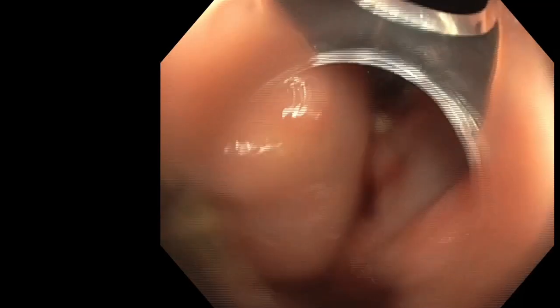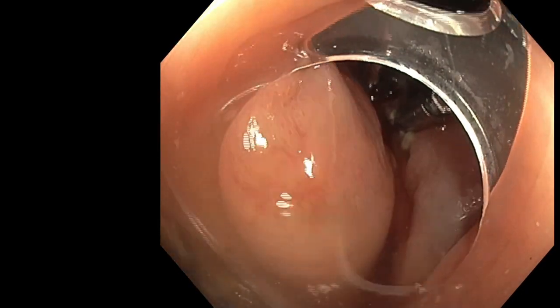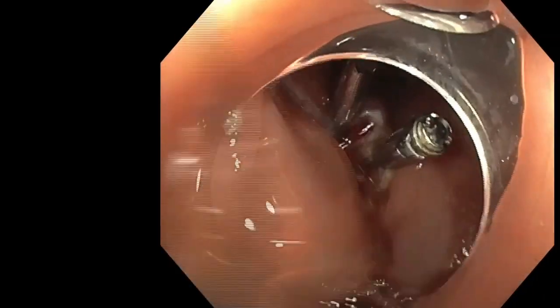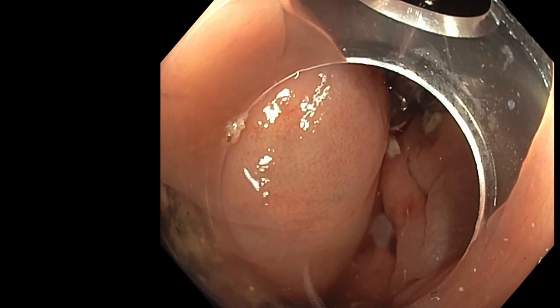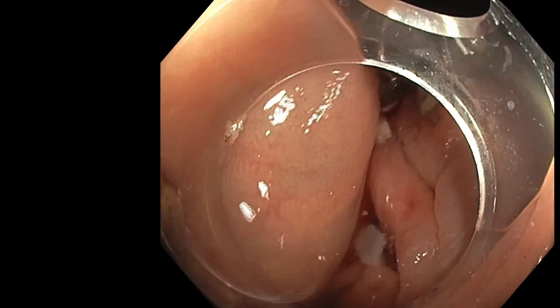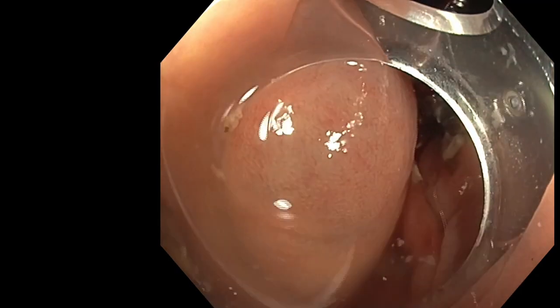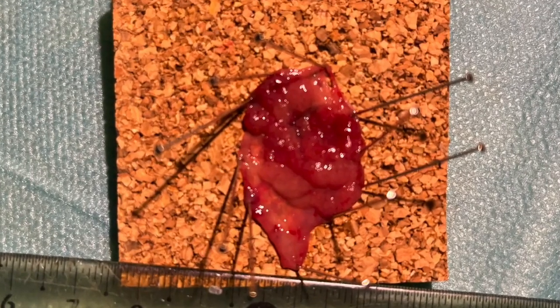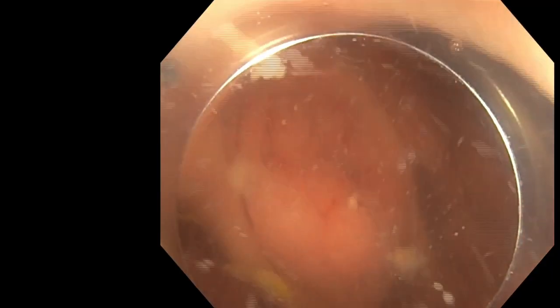So we like the Boston one when we need something precise to turn by ourselves, and the Creo one because it is reloadable and it reduces the waste and also the cost. Thanks to this reloadable device, the only disadvantage is the time, because reloading is not so easy. So this is the specimen with the diverticula at the bottom.